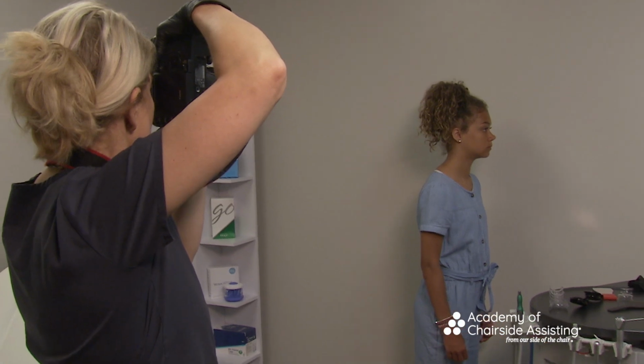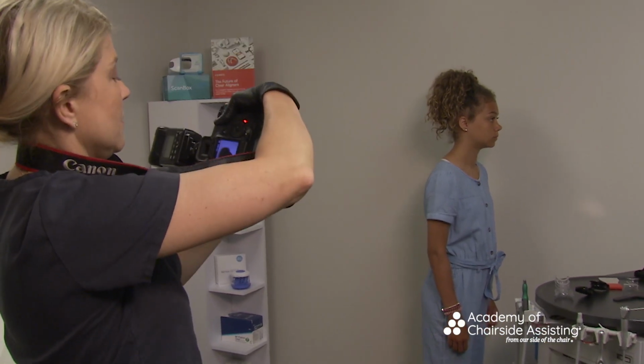Really nice. Now, I love vertical. I like it so much better than horizontal. So while you're staying right there, Kylie, I want you to bring that head up just a little bit. Hear that? I feel like she might have moved.